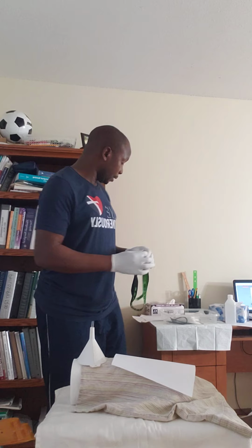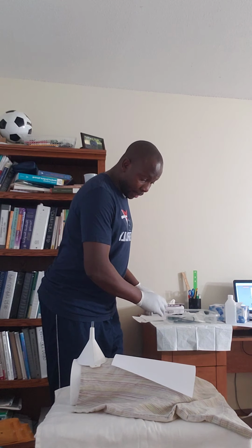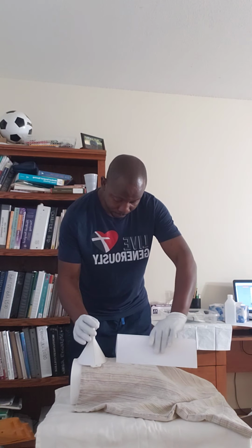Okay, not dry, to avoid causing an infection, and no pus or unwanted fluid. This is just moisturizing according to the order. Then I'll discuss everything, and then after that I'll take everything.